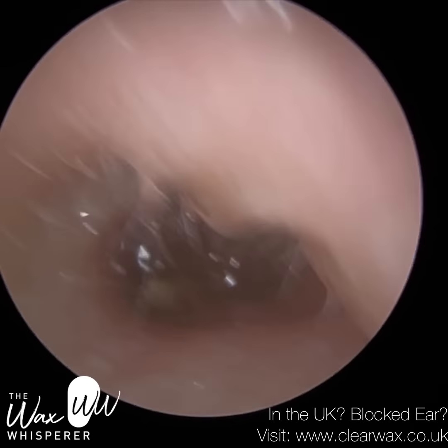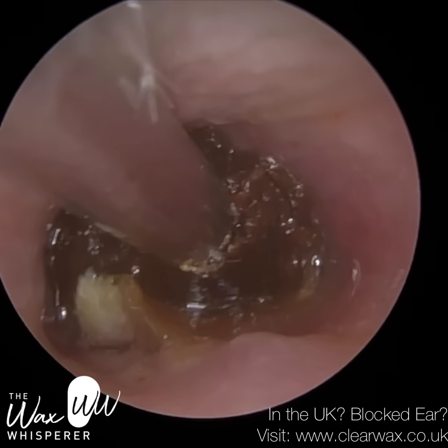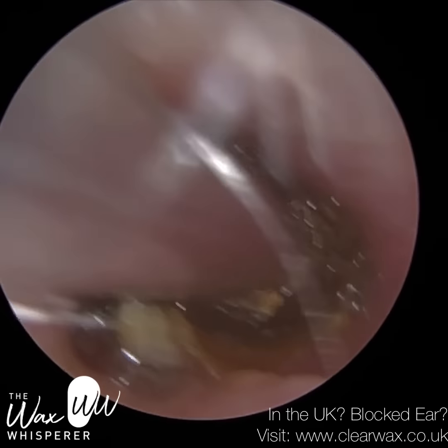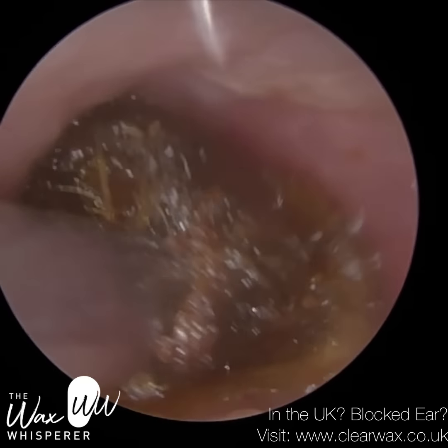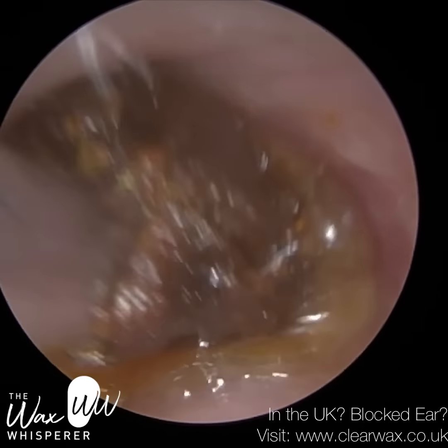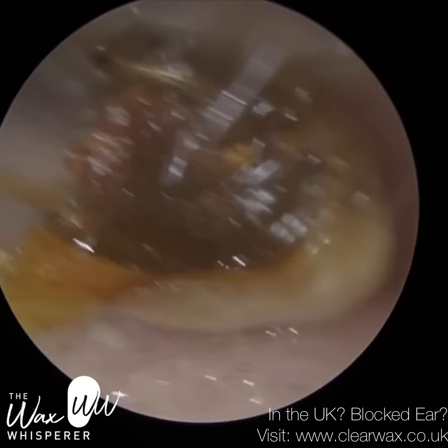And at this stage, on the tissue, the patient's probably thinking it's been at my ear for 20 minutes and there's only a little piece of wax being removed, but they could feel the resistance in their ear. And at this stage, this is the final bit, the patient initially found it uncomfortable. So as I put loads more drops in, the plug came off the eardrum and the patient could feel that particular point. But the patient remained still.